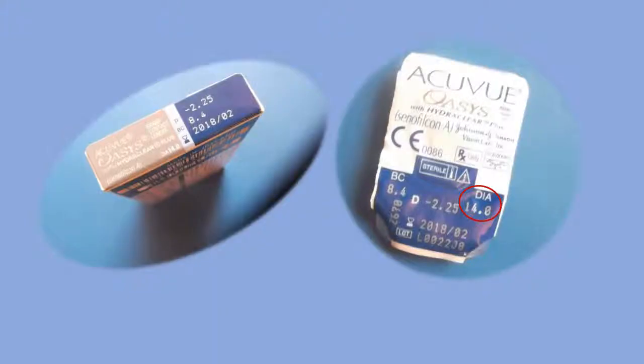Okay, one last thing. I'm not going to go over diameter of the lenses in this video. It's just too darn long. That's really the only reason. When we talk about the gas permeable lenses, there's a lot more to talk about as far as the diameter. So we'll also discuss how it affects the prescribing of soft lenses in another video. But I just wanted you to see the packaging where you might find the diameter and what it looks like.